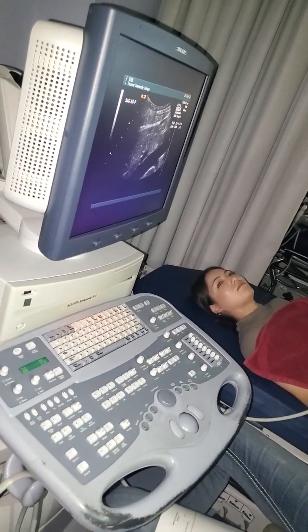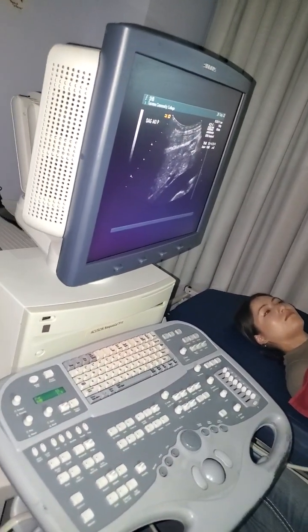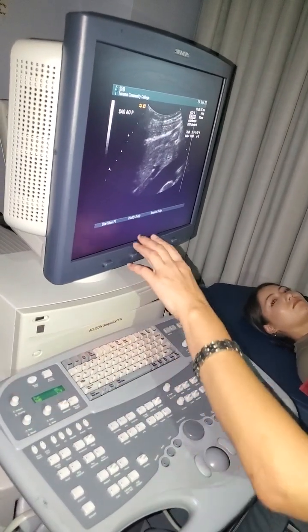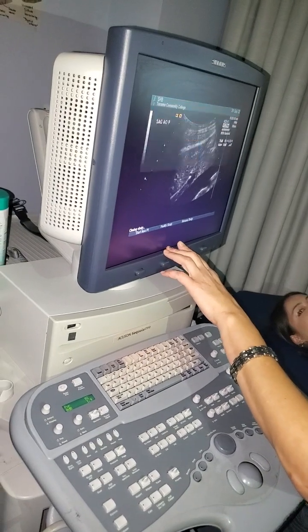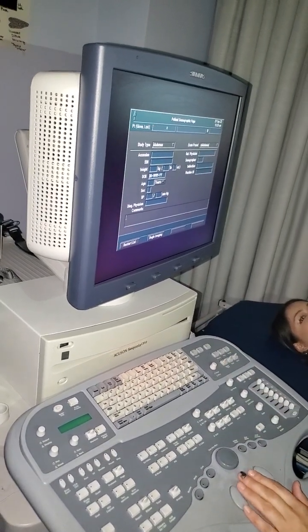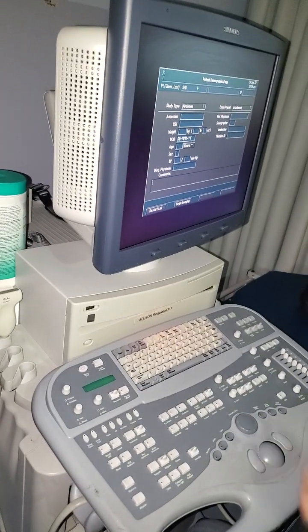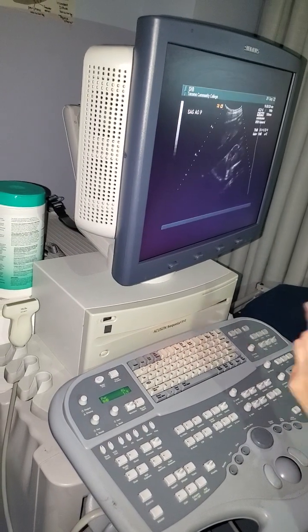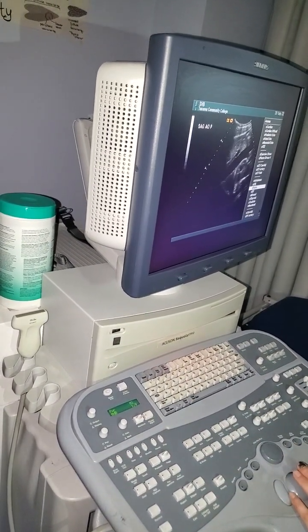And then new patient. So we did that kind of when we started the exam, that beginning of the exam. Exam selection. So when we initially started, we started in the abdomen setting. So begin imaging. But say I wanted to change that, I could go up to this button, exam presets, and now I want to do, we're doing a pelvic.